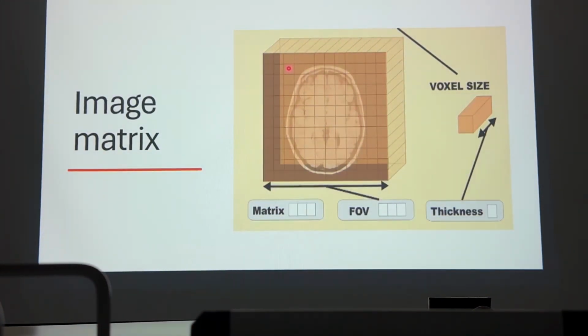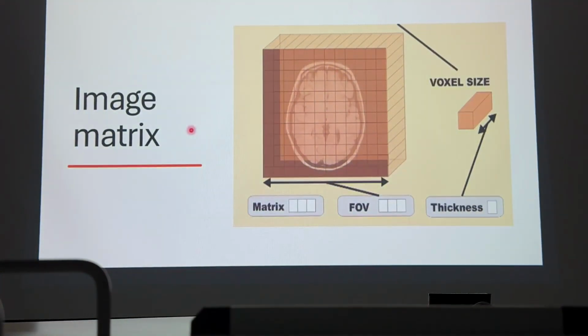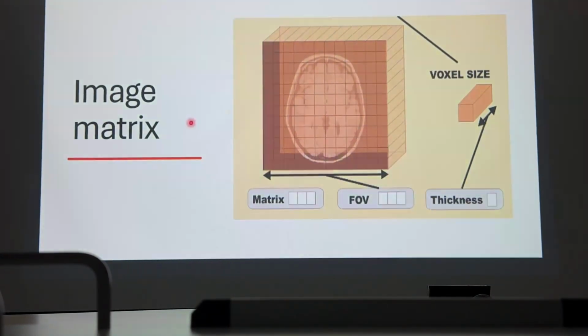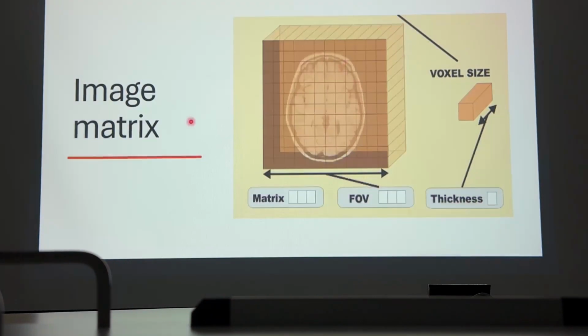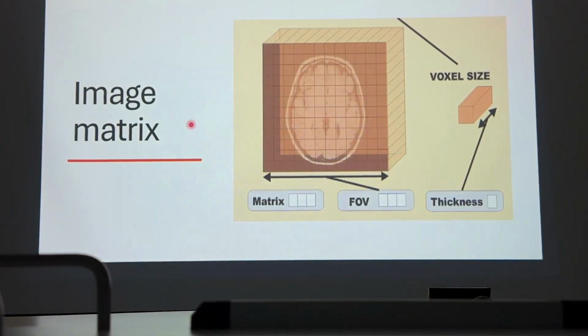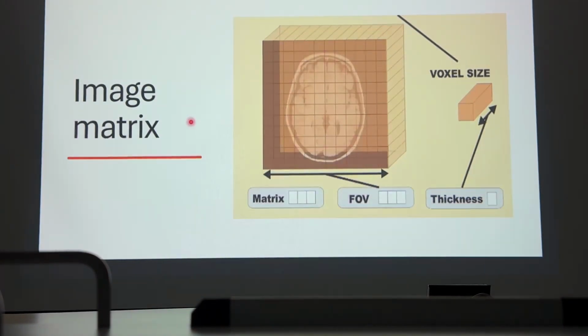These are the major definitions that we need to know when talking about noise in the MRI image. In conclusion, according to this information, the fact that the MRI image is not created by pure MRI signal is completely true. It is rather a combination of MRI signal and unavoidable background noise. So we can say that the MRI image is signal plus noise. If we want to improve the image, we have to strengthen the signal and reduce the noise, because the noise is always present to a variable degree in every MRI image.